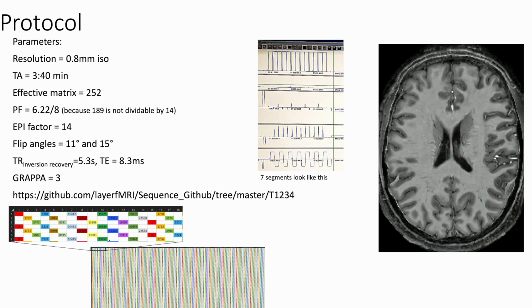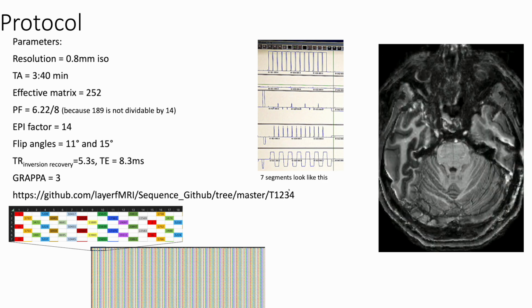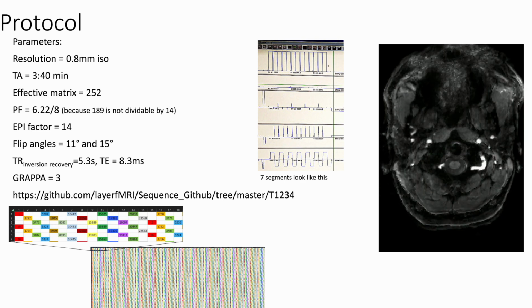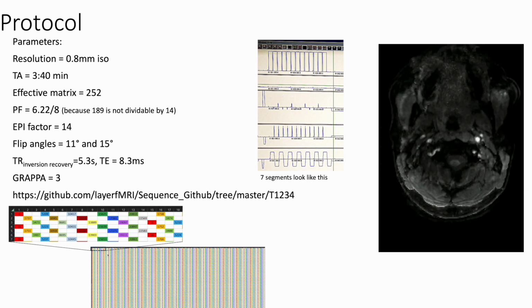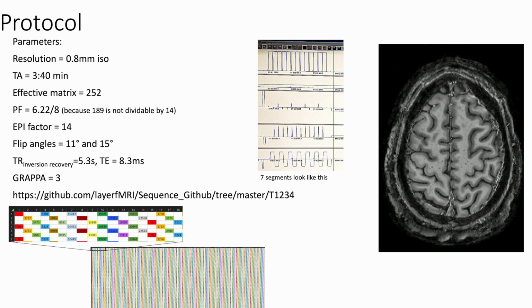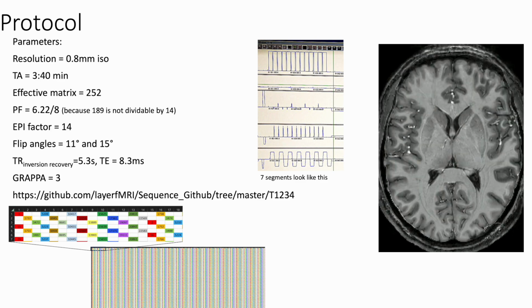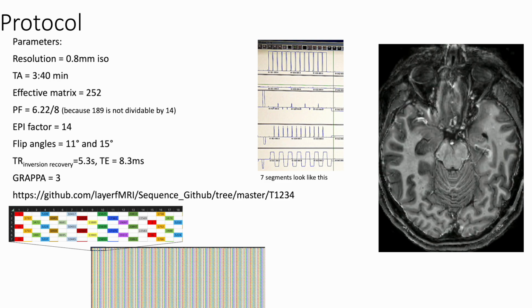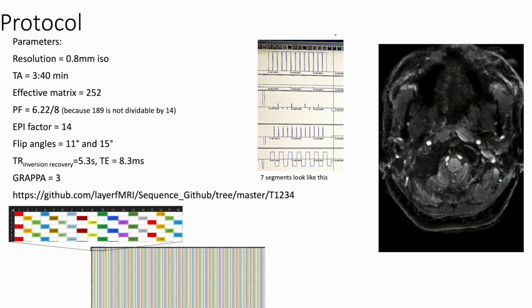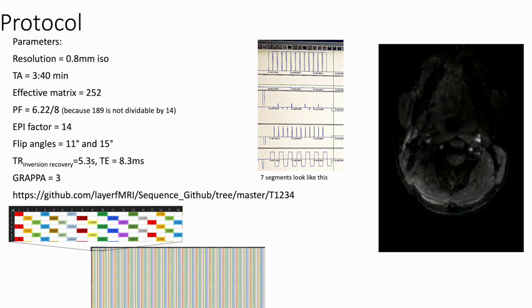In order to have a smooth transition of the T1 weighting in K-space, this means that we still need to wait for the time, even though we don't acquire the data, which is kind of wasteful. But we definitely want to have the T2 star issues in one dimension and the T1 issues in the other dimension. Both of them in EPI result in blurring and issues, but we need to keep them orthogonal. Otherwise, we run into all the issues that people have with, like, 2D GRASE, for example. So we have sometimes a line where the ADC is off. It's a bit wasteful. Those are the optimal flip angles for that protocol.